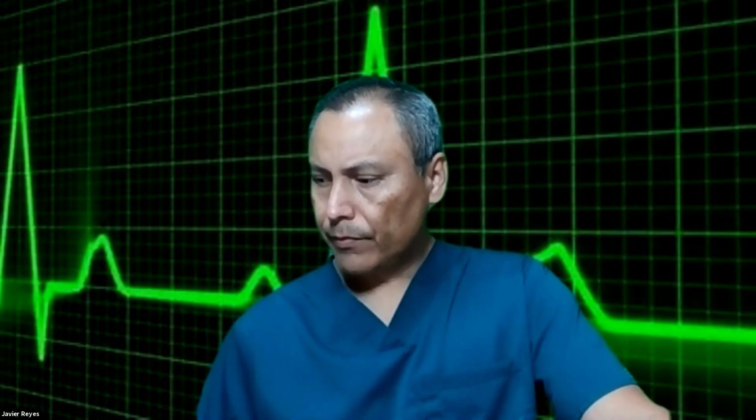Then we went into junctional escape rhythms. A junctional escape rhythm originates again in the AV junction. It has retrograde P waves and at the same time stimulates the ventricles. So we're going to have escape rhythms. Hold on a second. They are a bit different. What makes an escape rhythm a little bit different? An escape rhythm is not going to have an underlying rhythm like the premature complexes. You're going to have a completely different junctional escape rhythm. And what really makes it different is the heart rate.